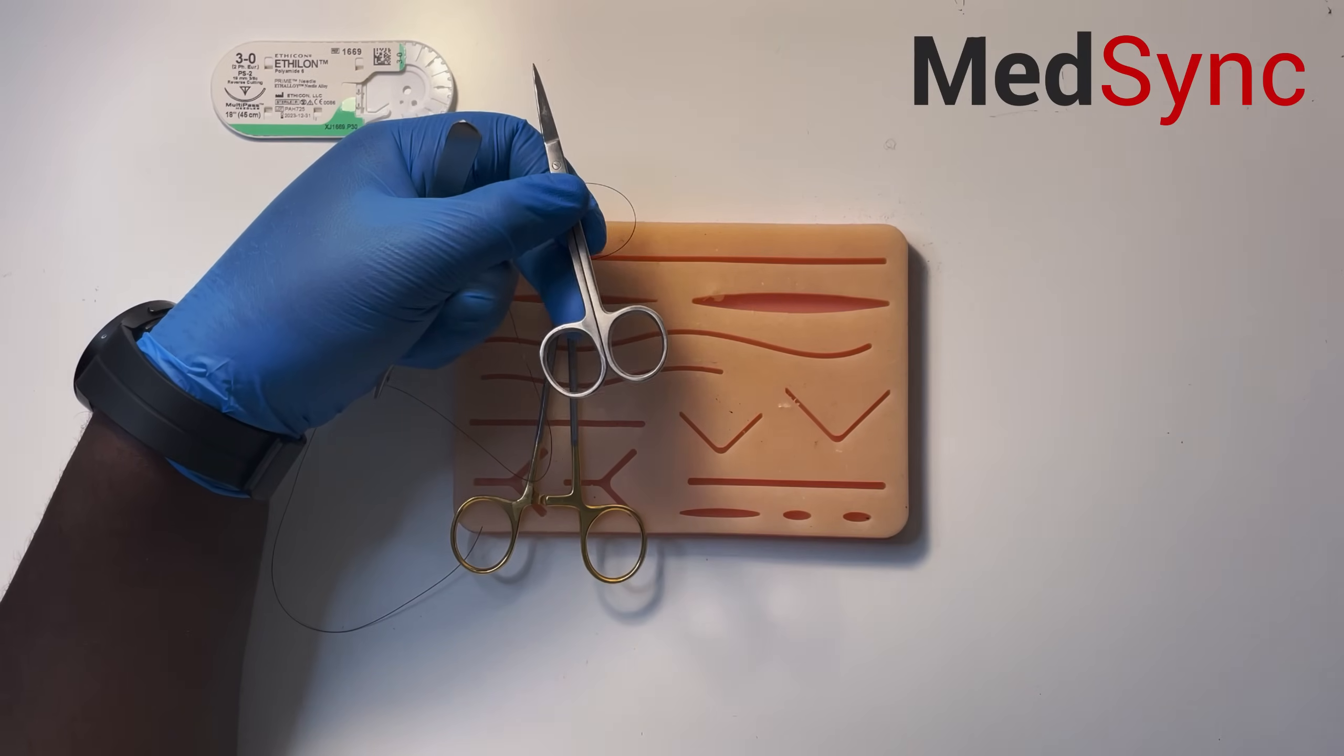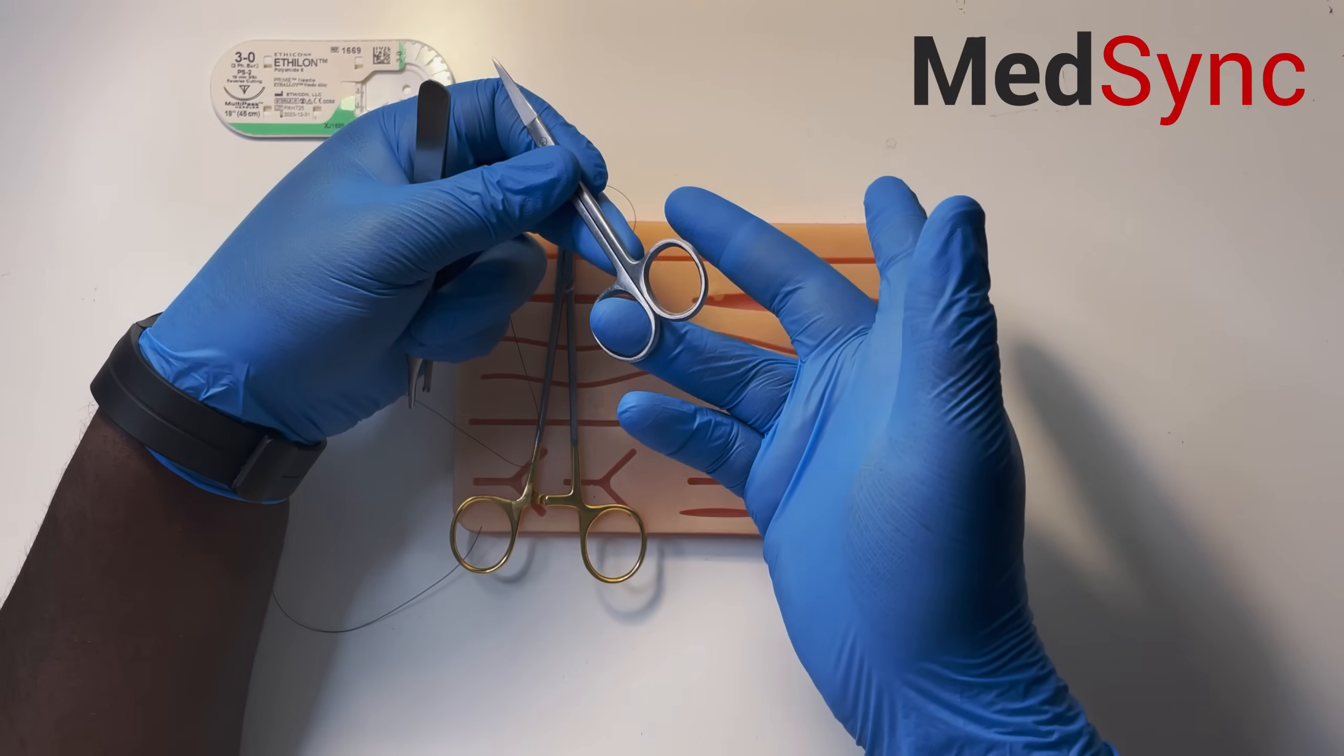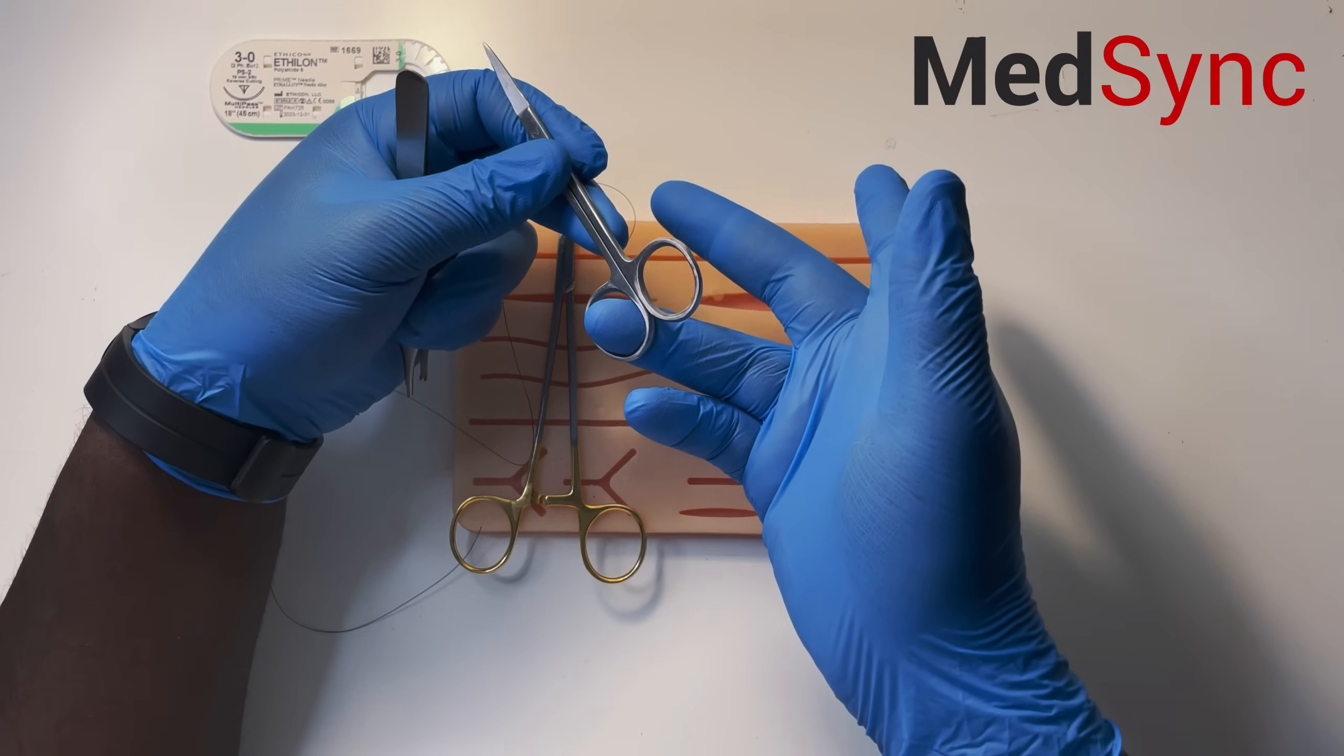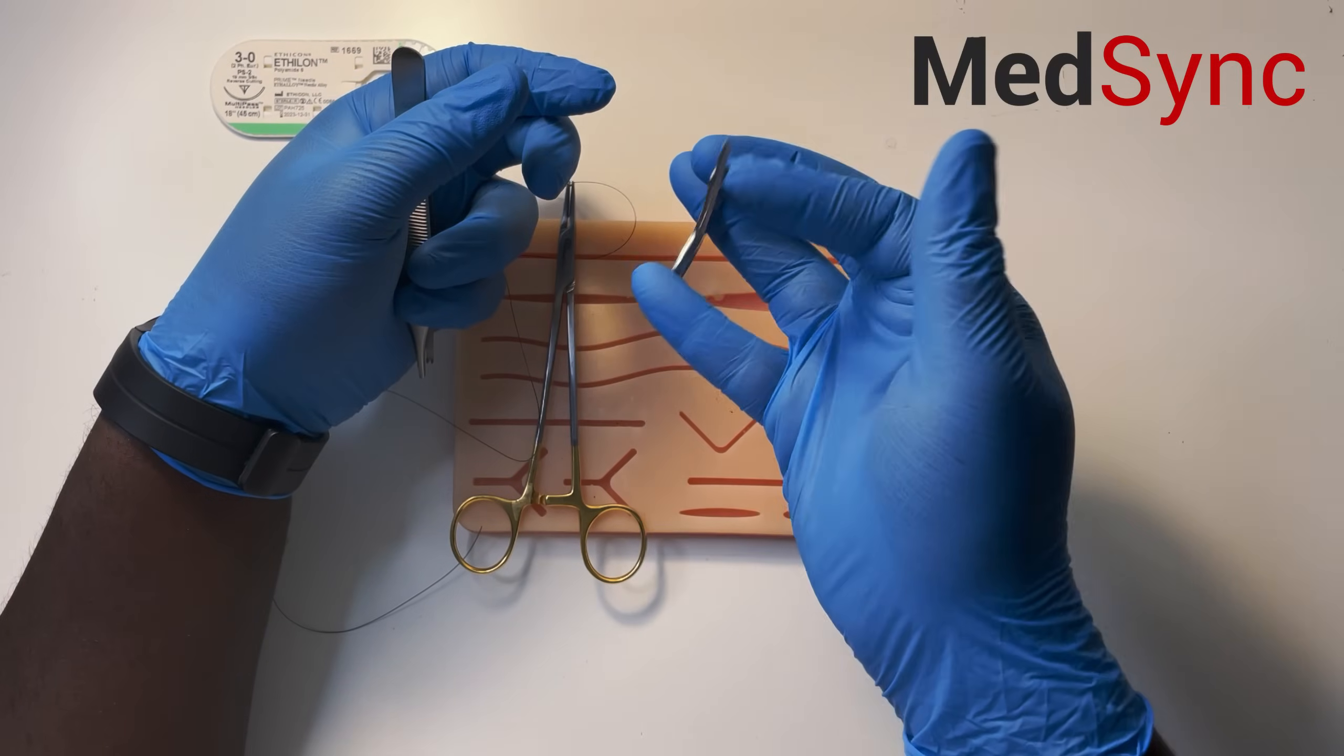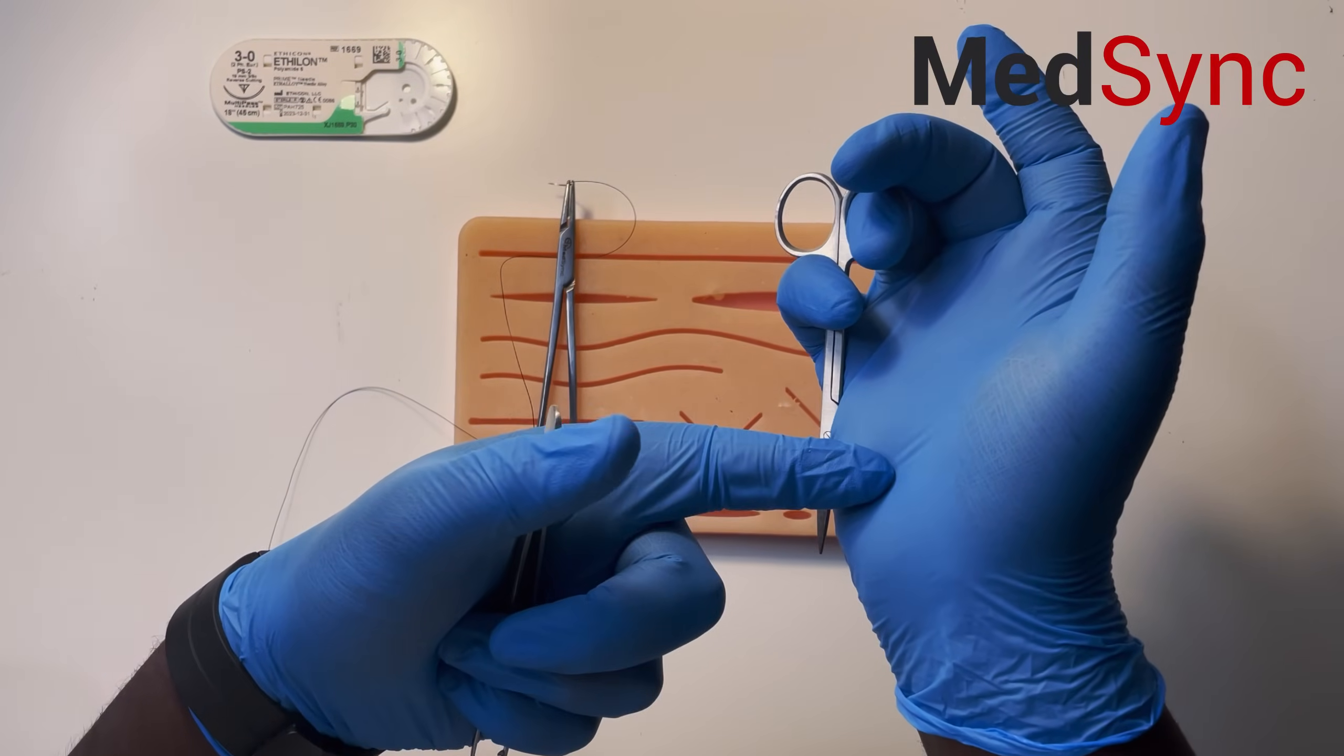When you've only got a basic suturing kit and you haven't got an assistant, you need to palm your scissors to cut quicker for yourself. Put your ring finger in and turn the scissor downwards towards your palm. Have it on the side so it doesn't go into your hand.